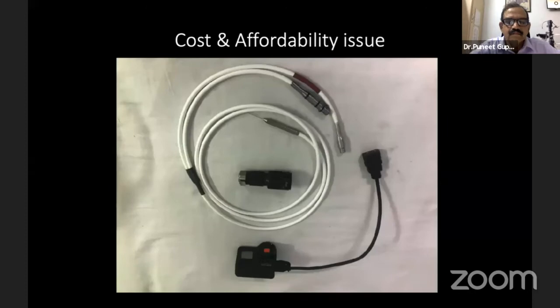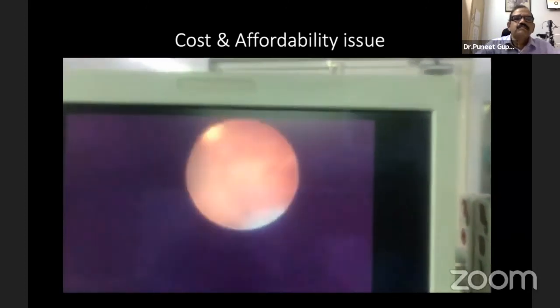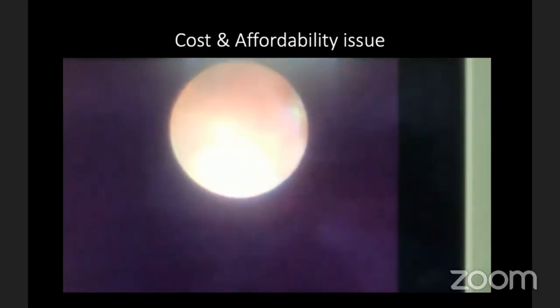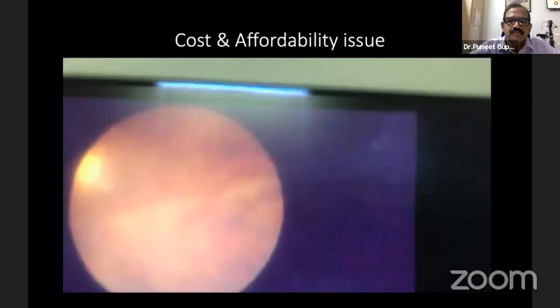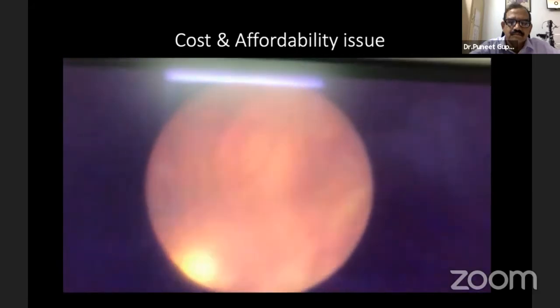This is the endoscopic view with this new endoscope using a 23-gauge fiber optic cable. The resolution and illumination both are better than the commercially available system. If you connect this endoscope to a 4K monitor, the visualization will be even better.